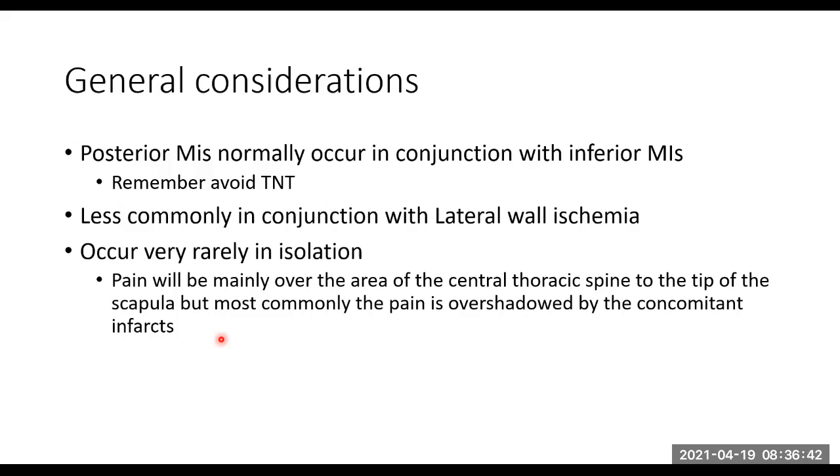Now this doesn't mean somebody was in a MVA and they've got thoracic pain, please do an ECG. No, I'm not saying that. But if it occurs in isolation, then please, there's no harm in doing it. To be honest, if a patient comes in with unexplained dental pain, they've been to the dentist and they can't find anything, unexplained ear pain, unexplained headaches, nothing is figuring out what's going on, there's no harm in doing this.